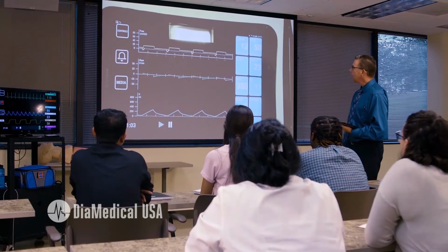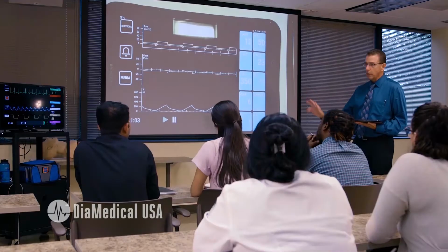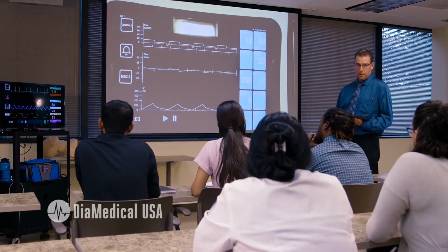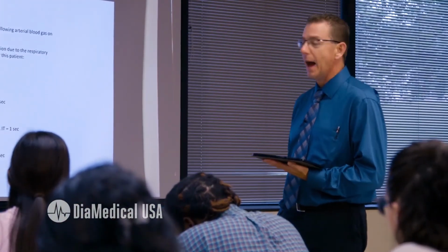Okay, so you guys really want B? Yes. Final answer? Okay, all right. So we're going to apply B, and here's your patient, now on the BiPAP, 12/6, with 50% FiO2. Now that the patient's been on the BiPAP for 30 minutes or so, do you want a blood gas? Okay, here's your blood gas. It comes back 7.23 with a CO2 of 71, a PO2 of 60, bicarb of 34, and a saturation of 85.